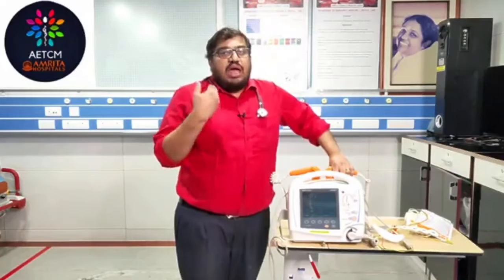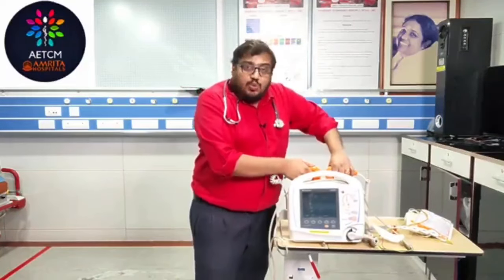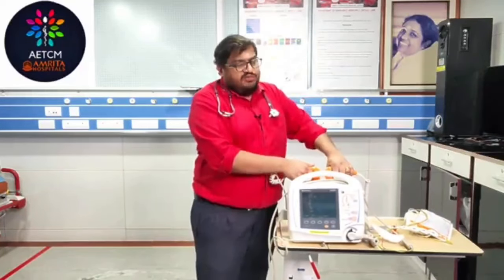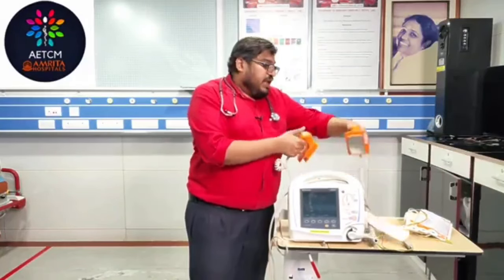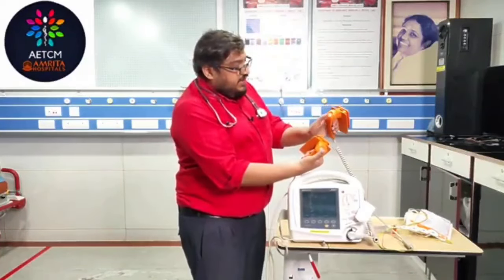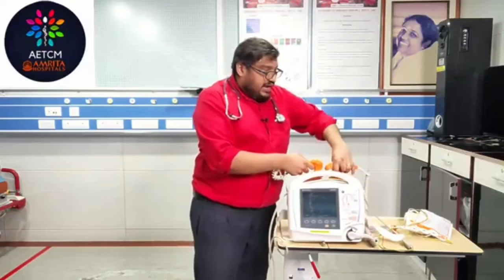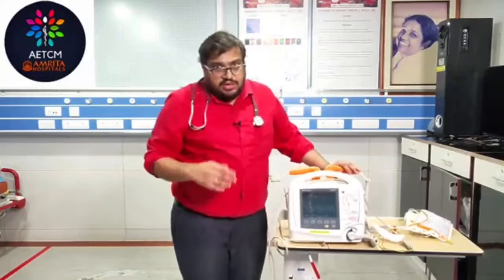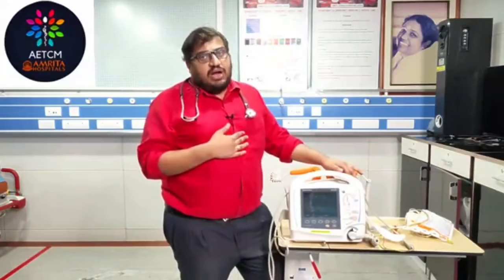As I told, one over the right side of your sternum and one over your apex, and make sure that no one else is touching, very important, because many of these things can go wrong. So make sure that no one else is touching. You shout, and you can see the shock delivery buttons here, two buttons here, and you need to press these two shock delivery buttons and deliver the shock and resume the CPR. So that is the method that you have to adopt for your defibrillation in case of a cardiac arrest.